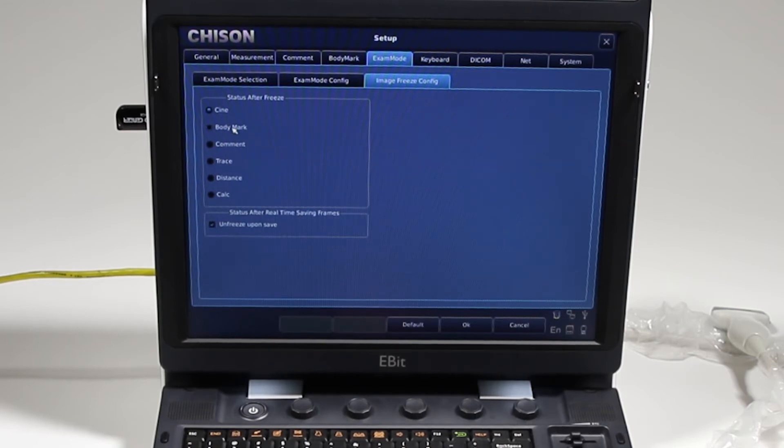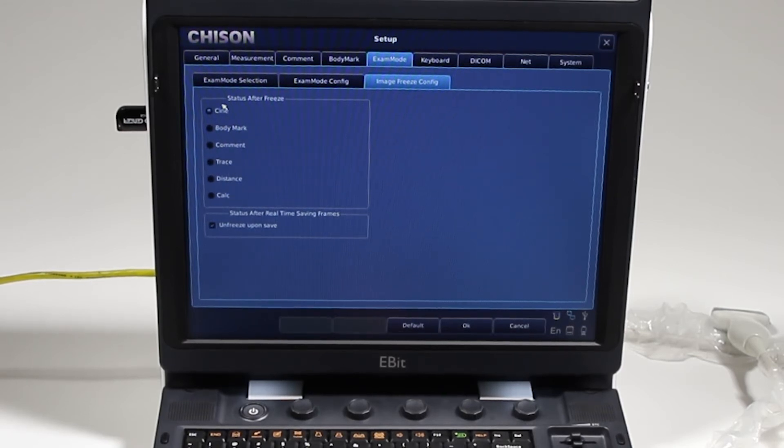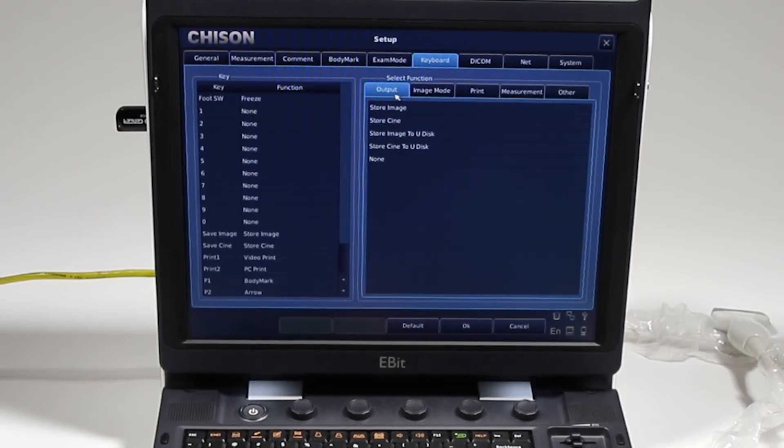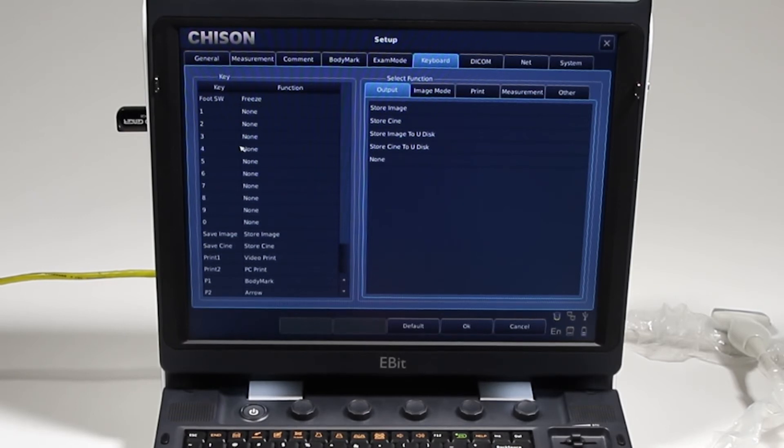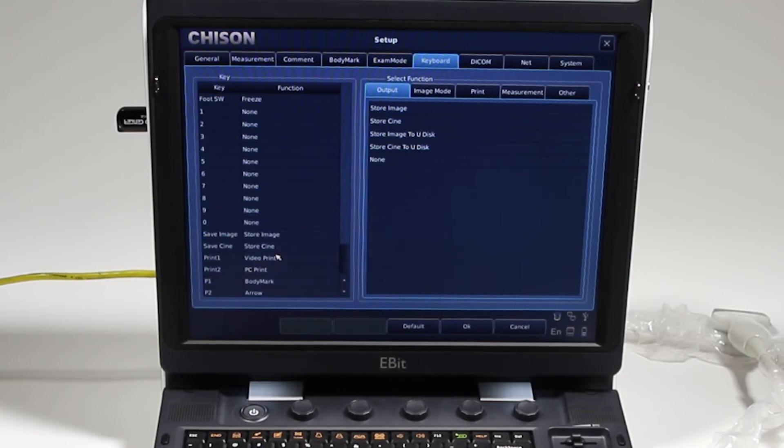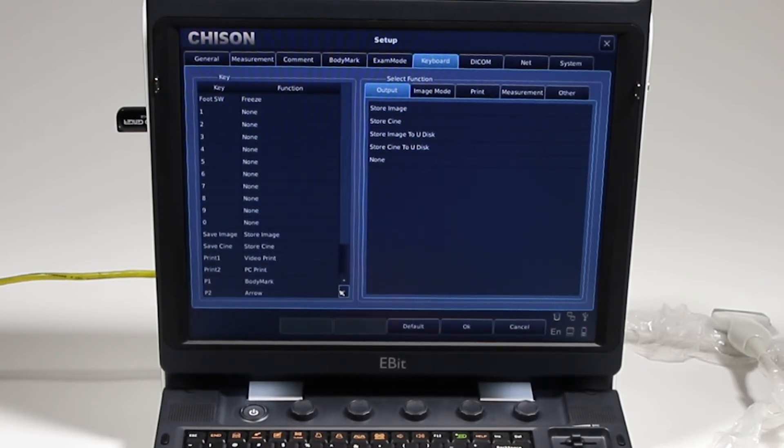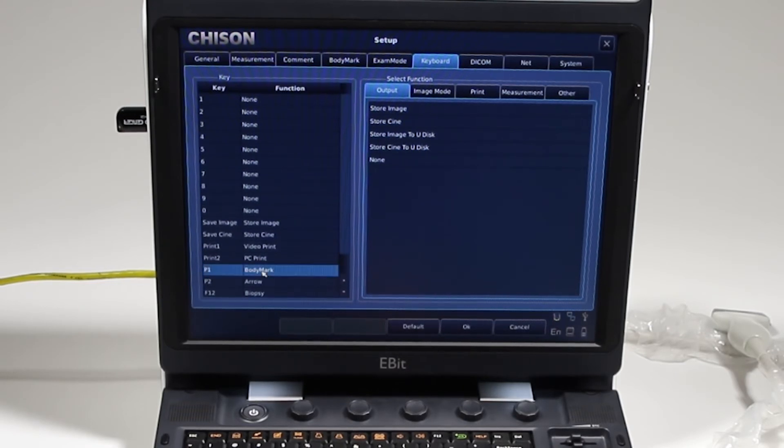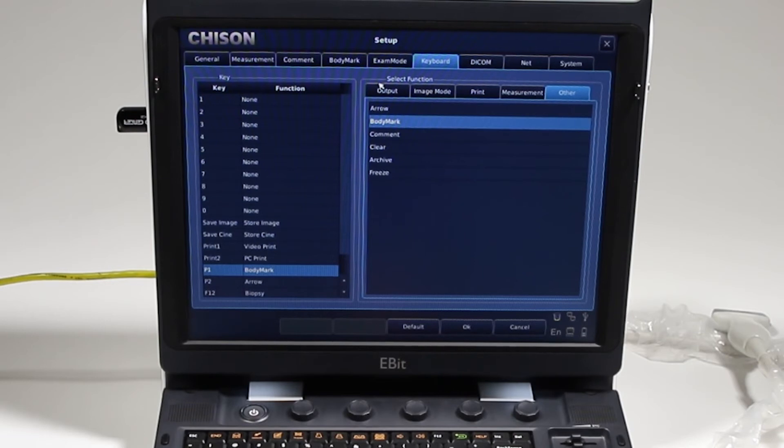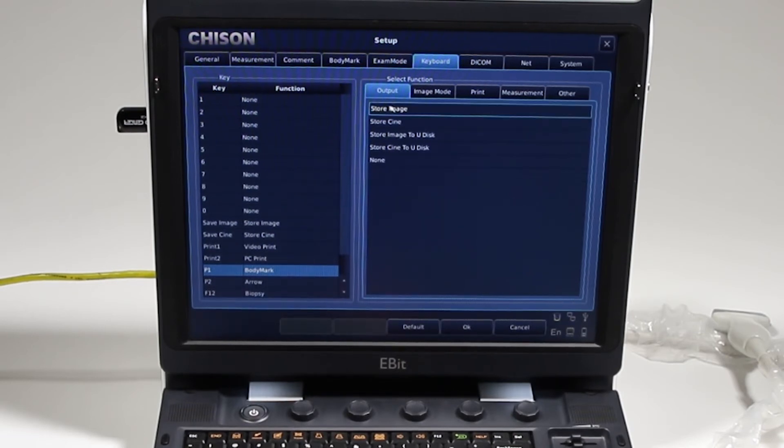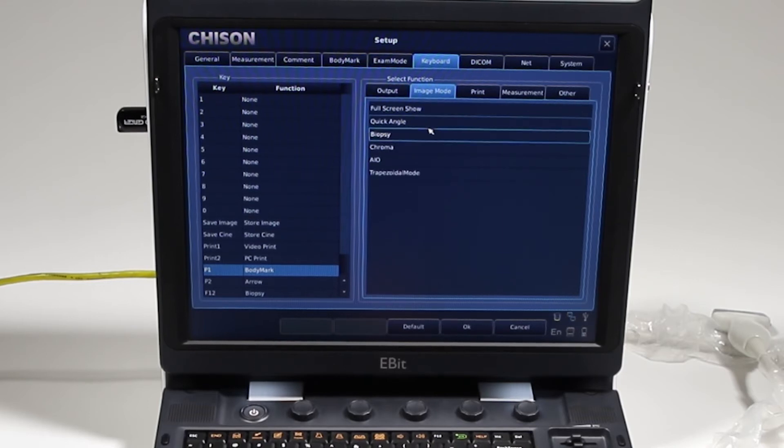What do you when you hit freeze? What's going to show up on that screen? Keyboard: here's we're going to set up the keyboard setup. Now you can change what the foot switch does: save image, save cine, print one, print two, P1, P2, the body mark and the arrow. Like, this is where it's set. I can change this to do an arrow, a comment, clear. I can also have that P1 right here store image, store directly to the disk.